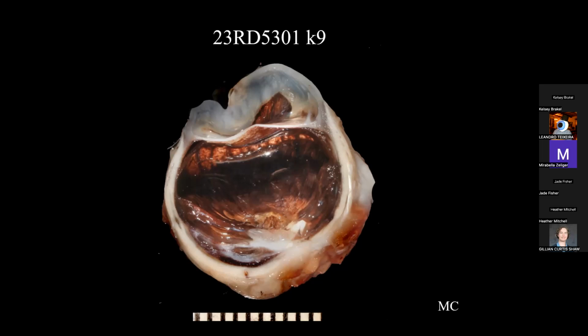This is one where they have the date of birth in there instead of the age. This is a roughly 15-year-old, I want to say, Chihuahua mix, neutered male. This dog has a history of trauma to the left eye in 2004. So kind of an old trauma. Recently, there's been corneal degeneration with subepithelial mineral and epithelial sloughing. And the globe was non-visual and phthisical, so they elected enucleation in this case. The other eye is unremarkable. So a really old trauma in this case.